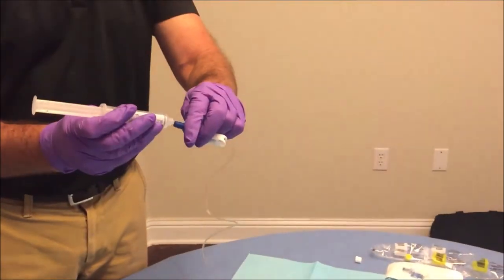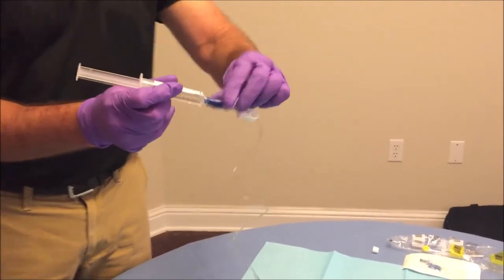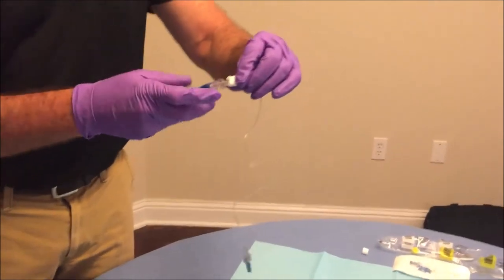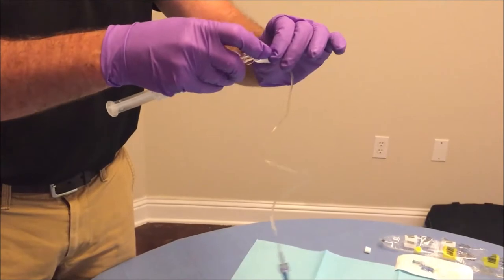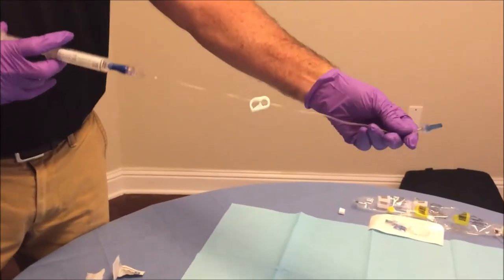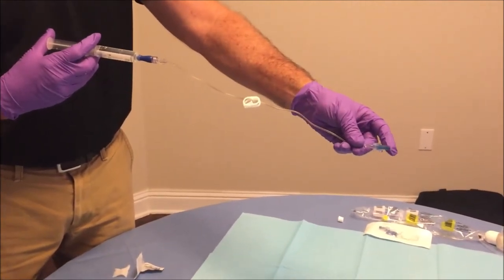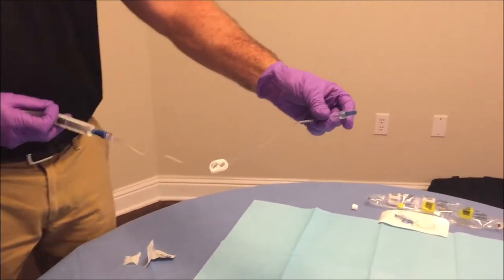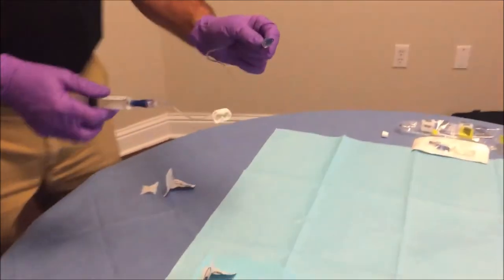Connect the saline syringe to the blue clave by pressing in and turning at the same time. Make sure to unclamp the white clamp by pulling the top tongue away so you can push the medication in. Push the medication in slowly until you see it start coming out around the blue cap. This forces all the air out of the tubing so you can later connect it to your PICC line.